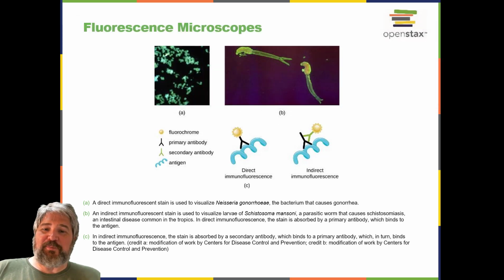In DFA, specific antibodies, for example, those that target the rabies virus, are stained with a fluorochrome. If the specimen contains the targeted pathogen, one can observe the antibodies binding to the pathogen under the fluorescent microscope. This is called a primary antibody stain because the stained antibodies attach directly to the pathogen. Any antibody that did not bind is washed away.